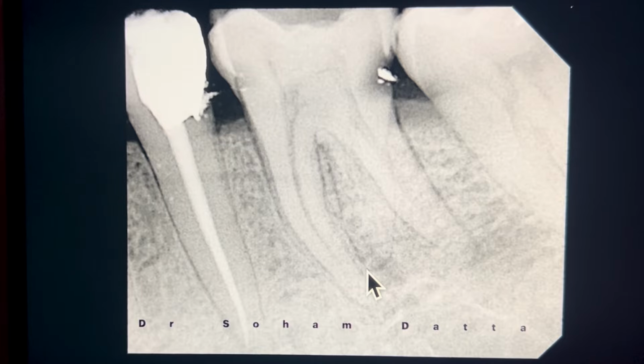Now these are the tips, and now two of my cases of radix entomolaris. This is the preoperative X-ray of tooth number 36, that is the left lower first molar. If you see the X-ray, there is caries present on the distal aspect approaching the distal pulp horn. In the pulp chamber there is calcification present here. The mesial root canals are visible, not clearly in the apical third, but in the middle third, yes, and in the coronal third they are visible.